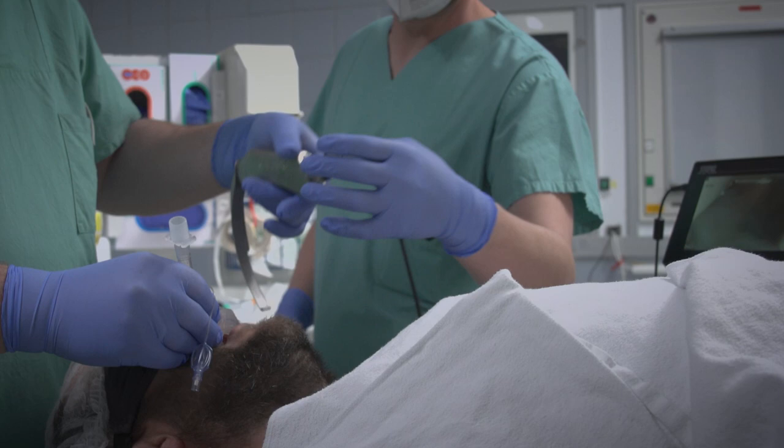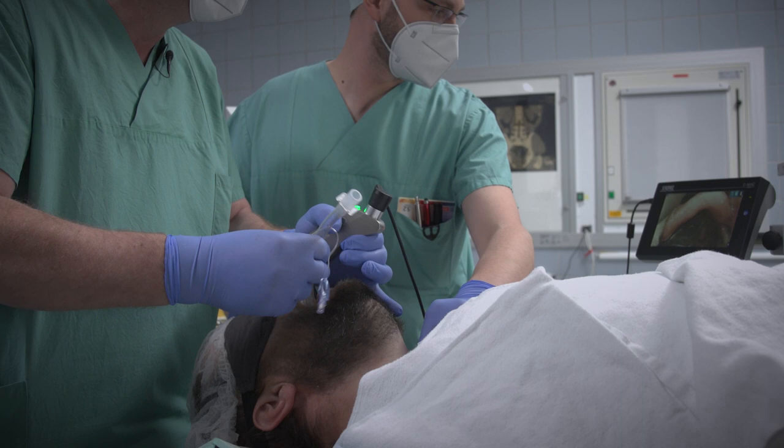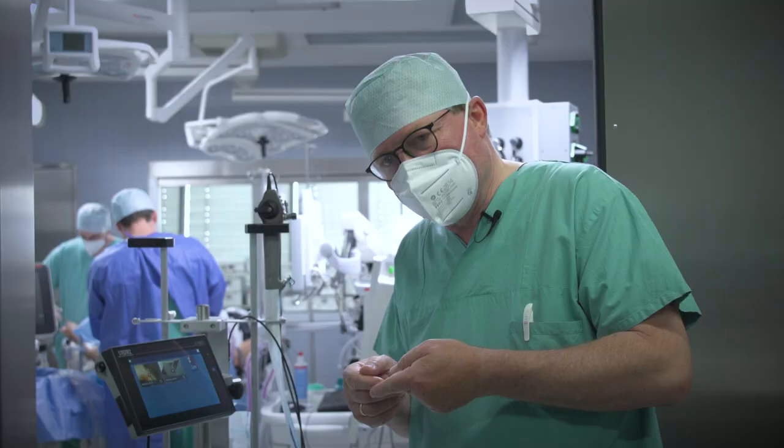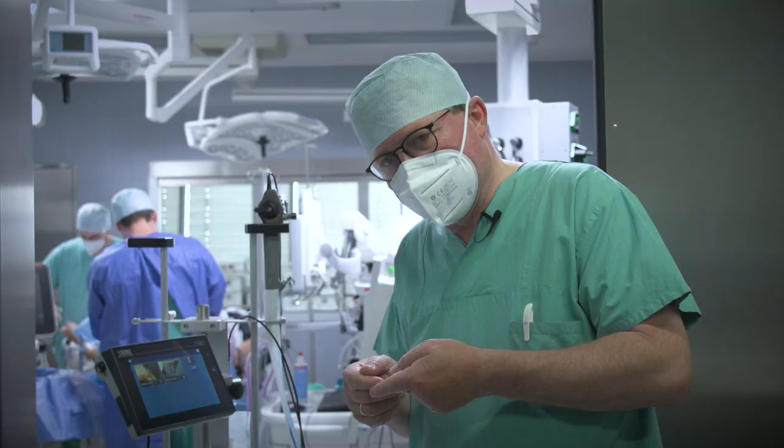Then you gently insert the tube. The important thing with video laryngoscopy is that you don't push the tube blindly into the patient's mouth while looking only at the screen. You gently look into the mouth of the patient to insert the tube into the oral cavity.